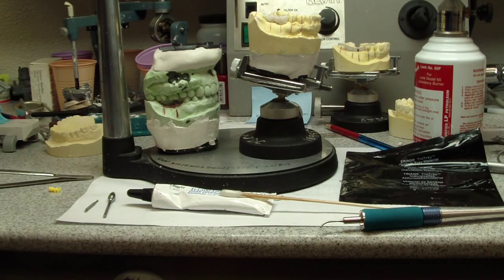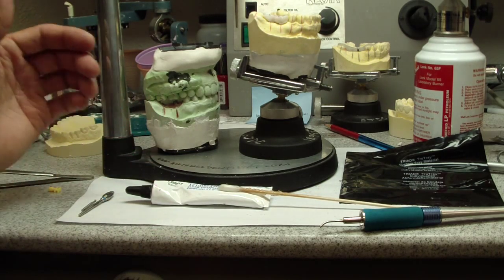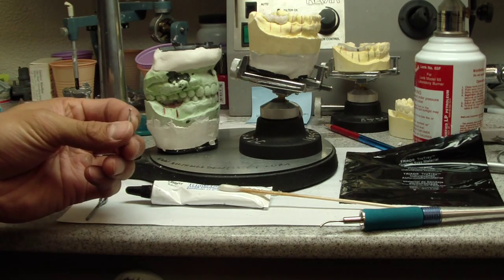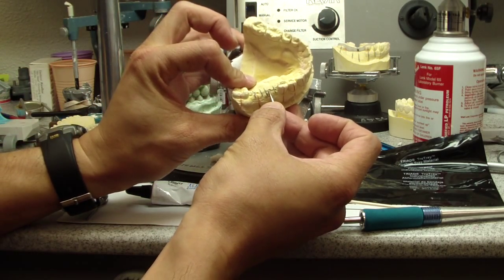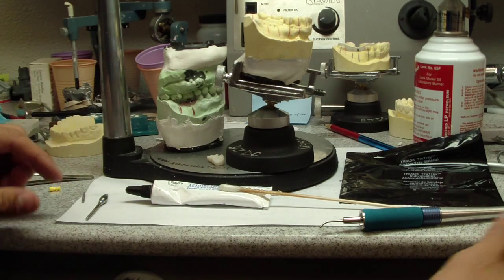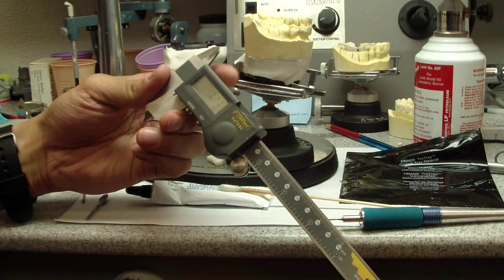Triad is just a little bit easier. You need some Vaseline because this stuff sticks to the cast. I'm also going to show you some flowable triad gel — it's visual light cure. You'll also want any kind of acrylic lab burr and some sort of 6-8 round burr. We use that to make a couple of divots in the cast where we want the 2mm twist drill to sit while we form material around it. Calipers are really handy, especially digital ones.